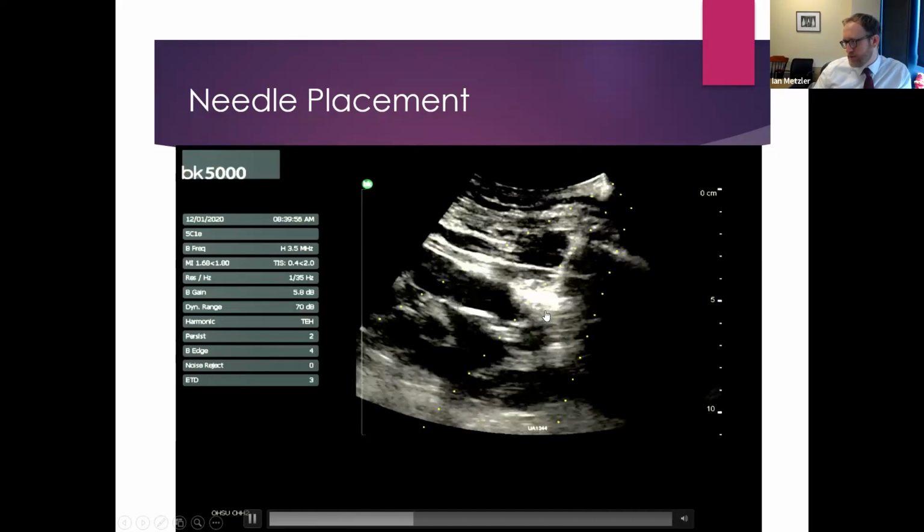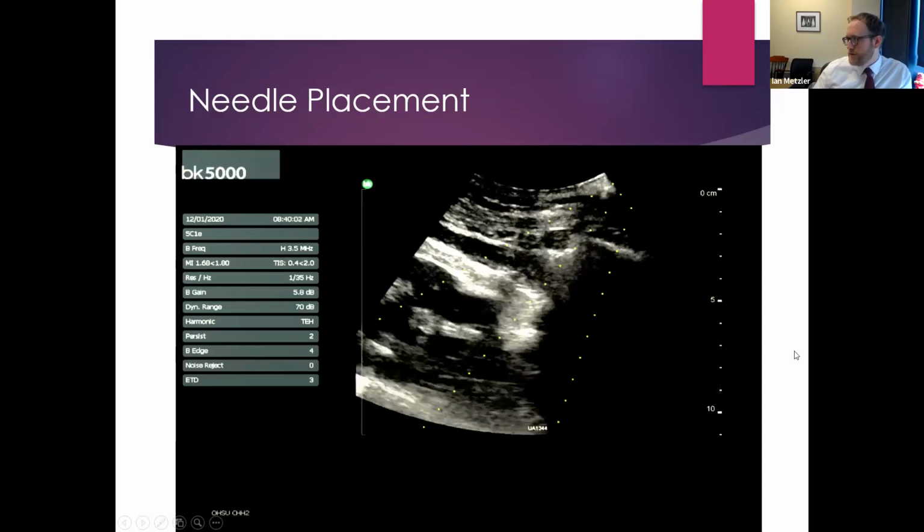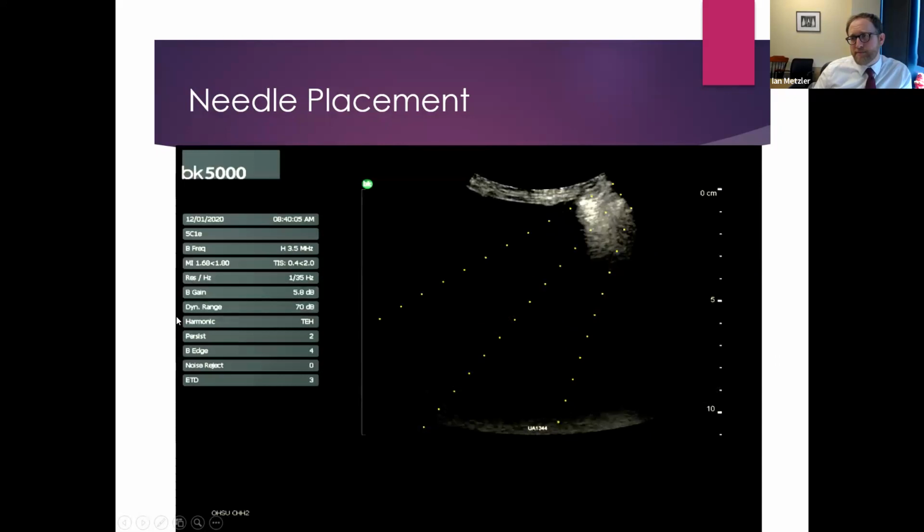You see the needle come into the subcutaneous tissue, it's moving the fat there, then it's pushing on the cortex, and then you pop in. So that's needle placement, and you can get specific echo tip needles for this, but if you don't have access to that, all it is, is the tip of the needle is roughed up with a pattern etched into it. You can actually take an 11 blade or whatever and etch your own needle. All you have to do is make several cuts in all directions in the tip of the last couple millimeters of the needle itself, not the trocar, and that will give you a much better signal on ultrasound.